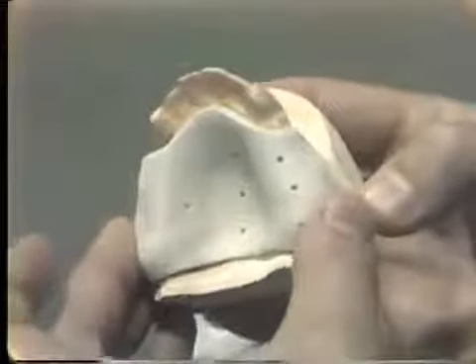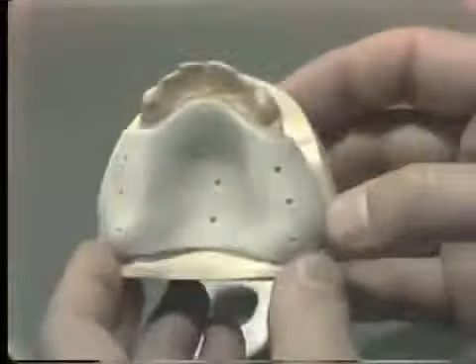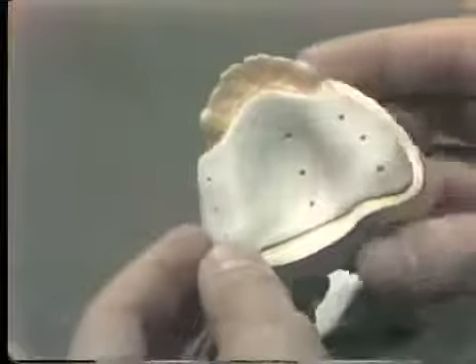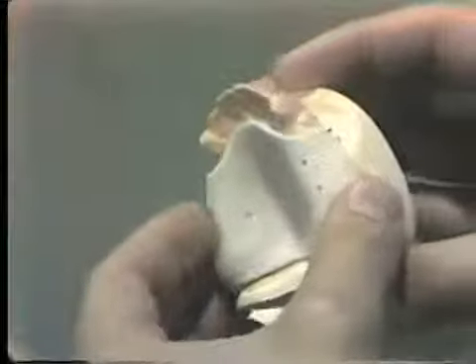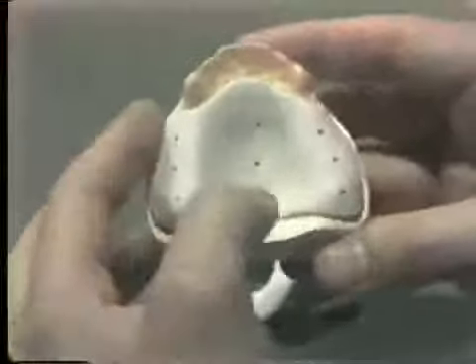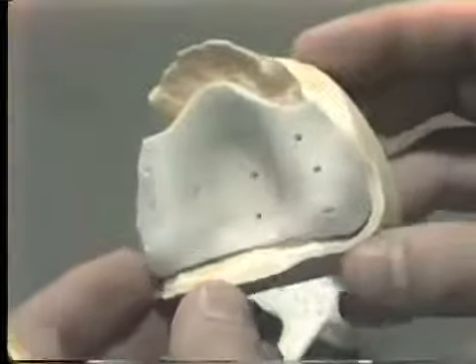The first tray that we made also is perforated with numerous holes in the ridge area and also in the palatal area to relieve the hydrostatic pressure from the wash medium. When these trays are taken to the mouth to secure our final impression for a maxillary immediate denture, the first tray is border molded in compound. All the peripheries are border molded, the buccal flanges, the posterior border. This anterior area is not border molded.